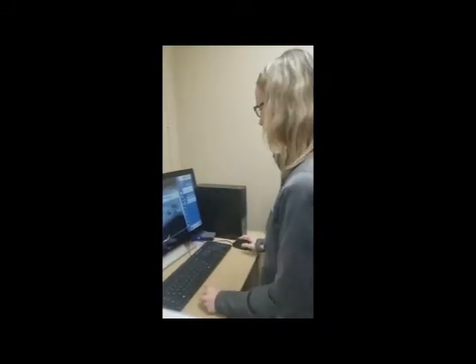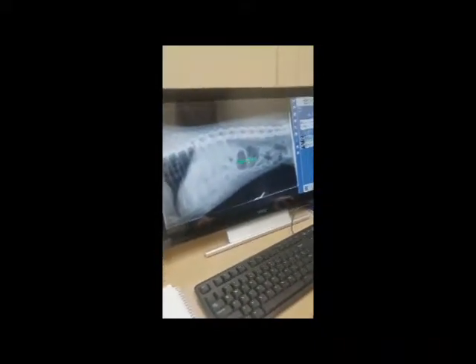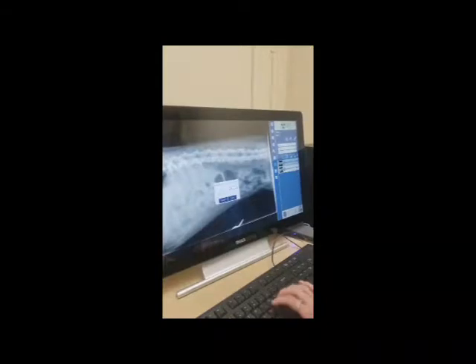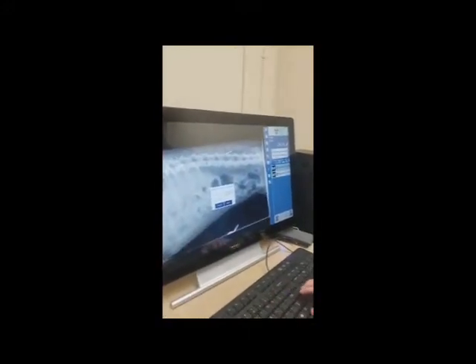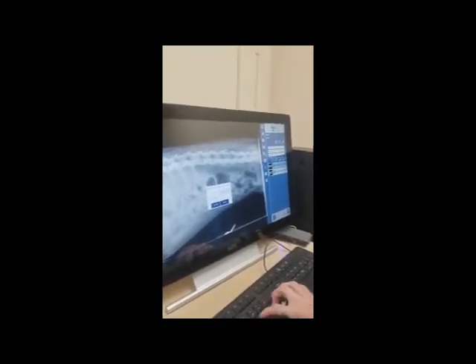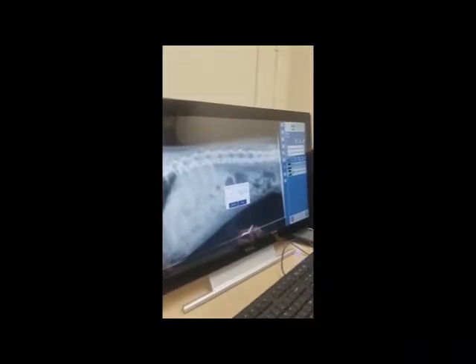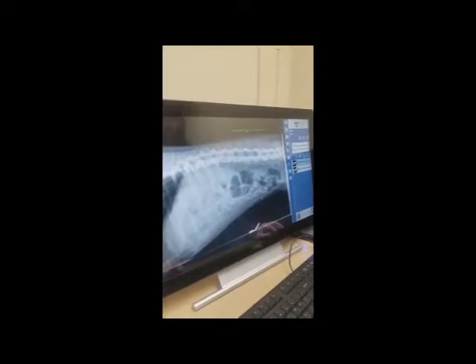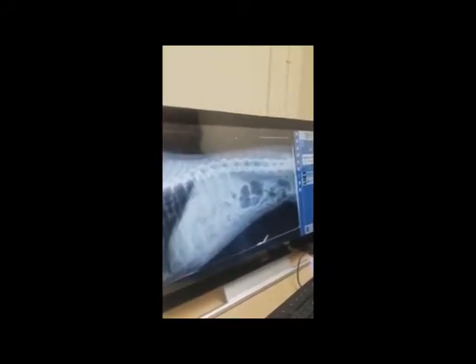We're going to label our x-ray with proper labeling. There's an 'A' for the text box — click on the 'T' for text. You want to put in the film number, the view (lateral abdomen), the hospital name (Oakland Animal Hospital), the patient's name (Bitsy Smith), and the date (02-21-2018), then hit save. Put the label off to the corner. It includes the patient, the date, the hospital, and what view you were going for.